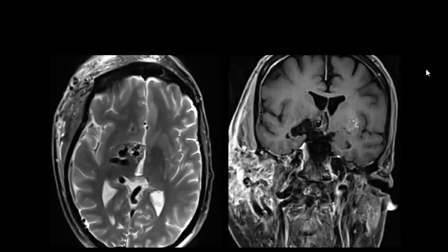I have been provided MRI brain, axial and coronal slices of an adult patient. An abnormal intensity lesion is seen at the right deep white matter at the level of the temporal lobe. It is also indenting the midline towards the left side. On post-contrast images, it is showing multiple filling defects.